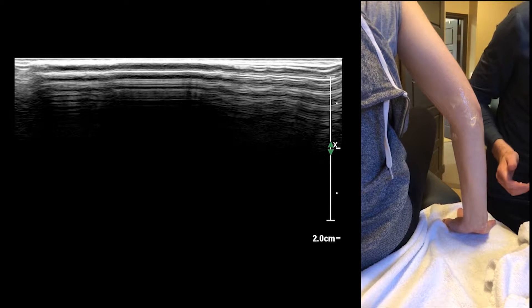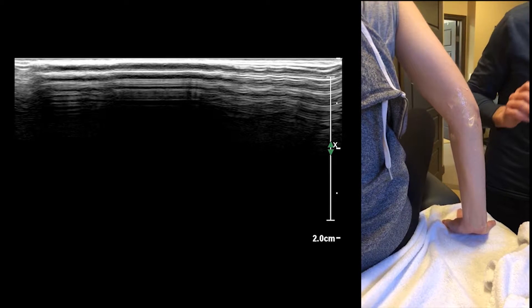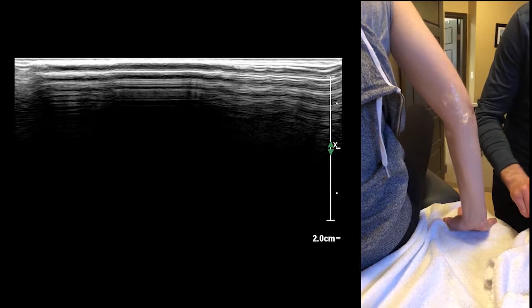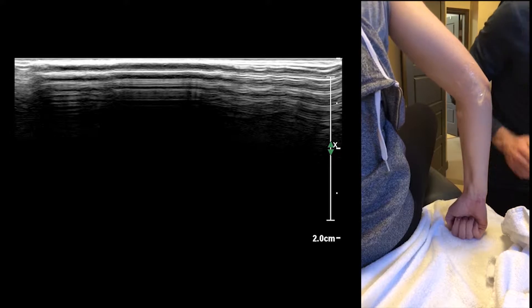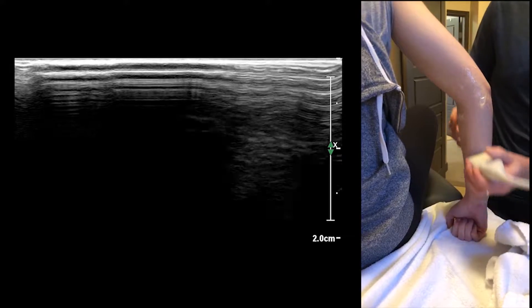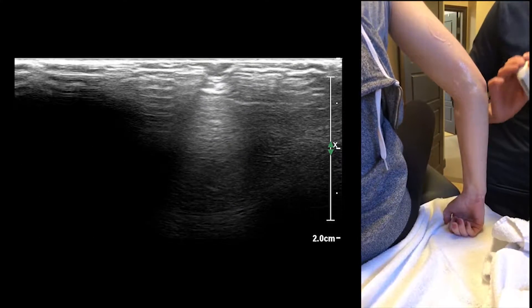Sometimes with polytrauma patients you have to do it side lying, then get them rolling, and then it's a really tough one. Anyway, let's try this — I'm going to start off with a superficial setting and let's see if we can find ourselves over here.